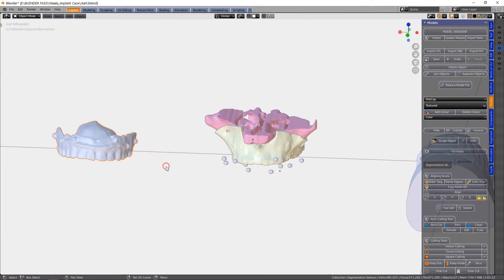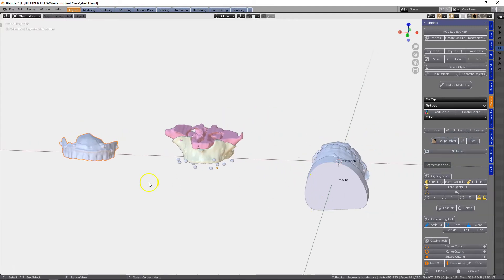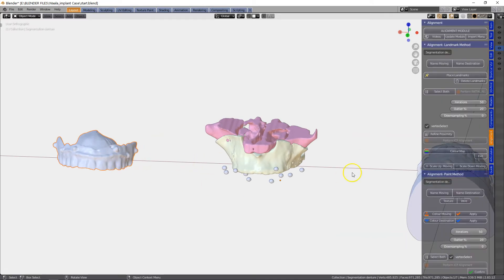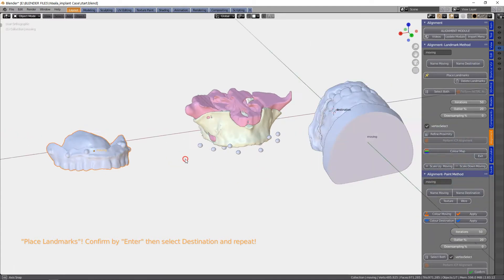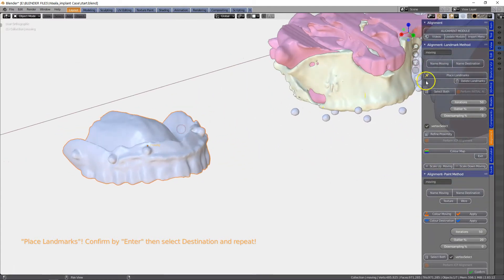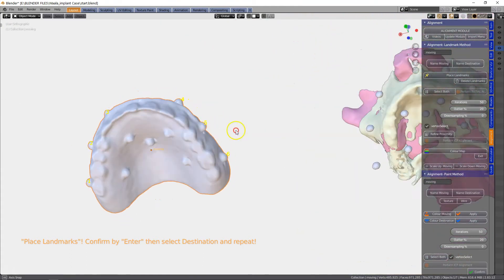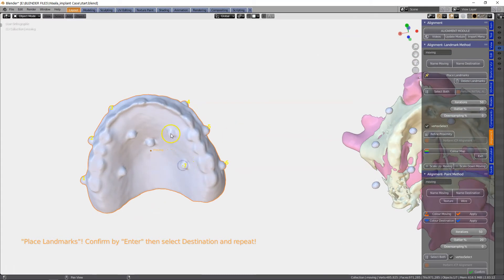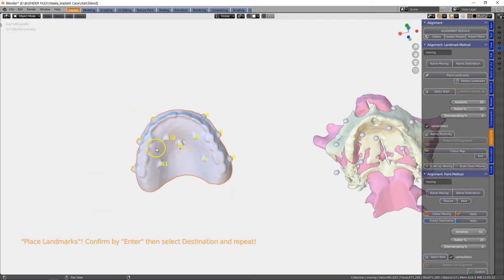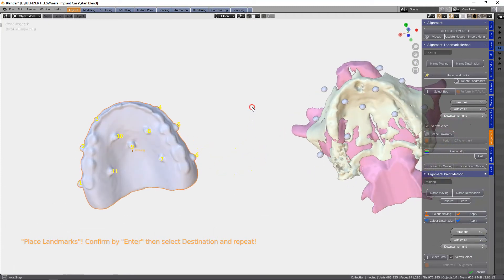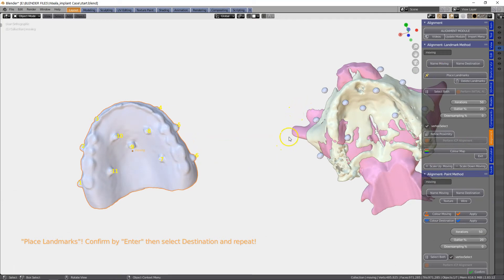Now we're going to align this to the markers, and then we're going to align all of this to the denture. We're going to go to the alignment module. This becomes the moving, and this becomes our destination. Let's place these — I'm going to go into an anti-clockwise direction. There's a lot — seven, eight, nine, ten. We don't need that many, honestly. Three or four is way enough, but there must be more than two. Enter. And we're going to do the same on this one. Place: one, two, three, four.